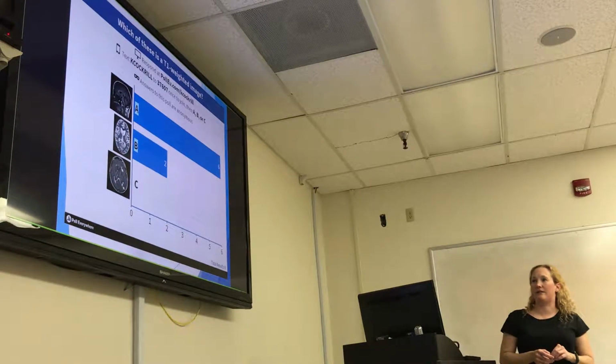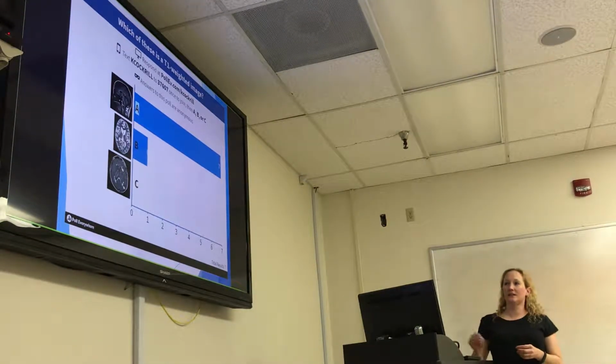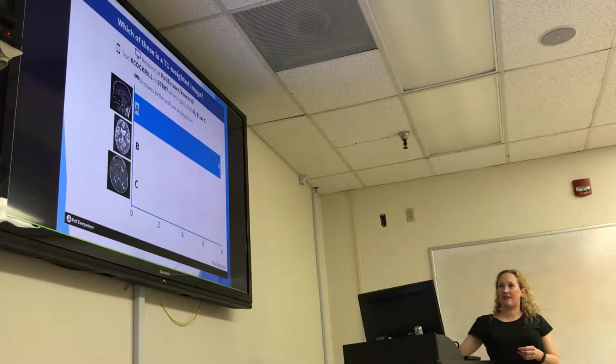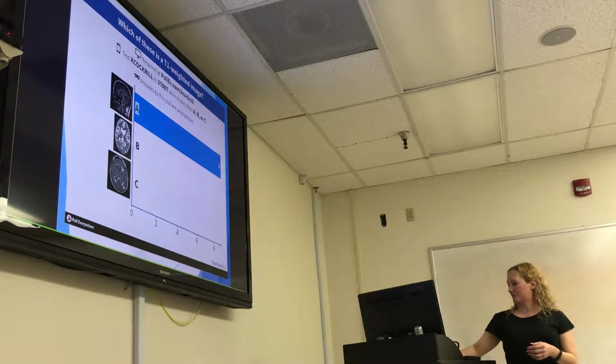We're looking for that nice dark water, nice bright fat. There we go. So yes, the answer is A. So it's the dark water that you're looking for, and that bright fat around the edges, and then your gray matter is kind of in between. All right.